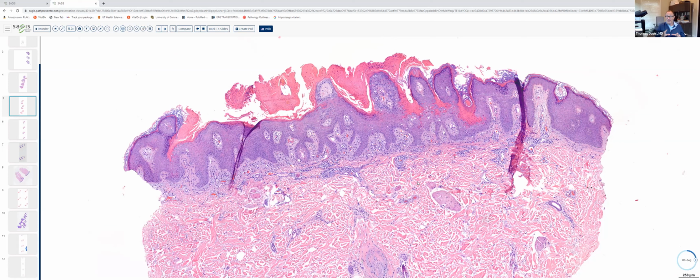It differs somewhat from typical variants of porokeratosis, again, in the presence of the papillomatosis, the epidermal hyperplasia, and the multiple cornoid lamella. So Porokeratosis ptychotropica can be a very difficult condition to treat, and some of the clinical presentations can be quite impressive.